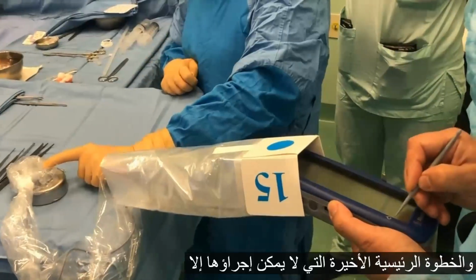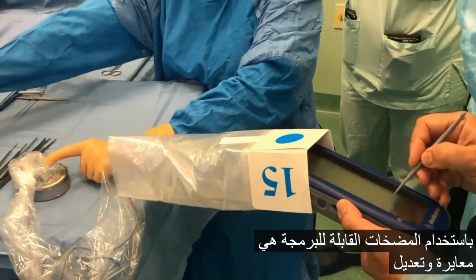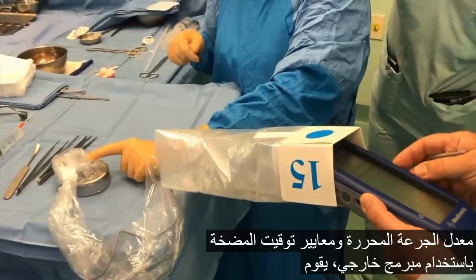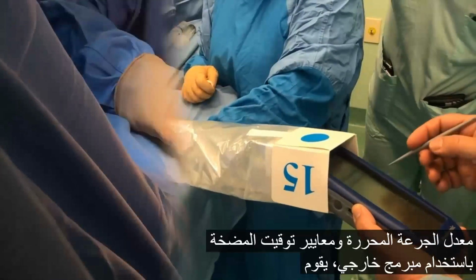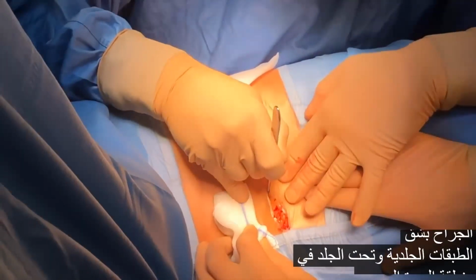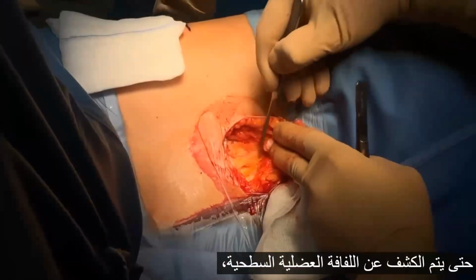The last key step, which can only be done with the programmable pumps, is the calibration and adjustment of the releasing dose, rate and timing parameters of the pump using an external programmer. The surgeon incises the cutaneous and subcutaneous layers of the left paraumbilical region until the superficial muscular fascia is exposed.